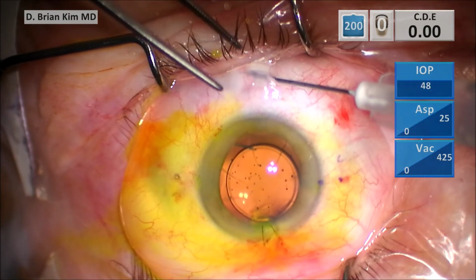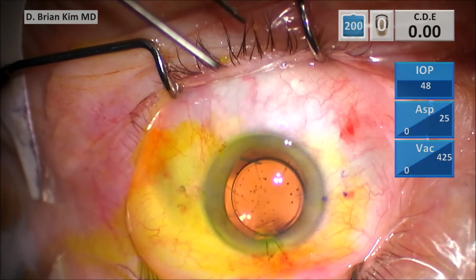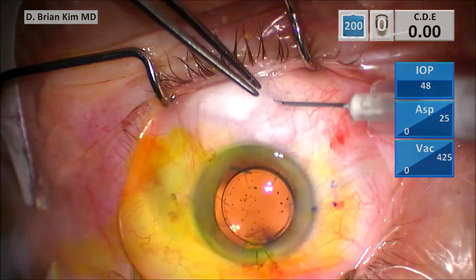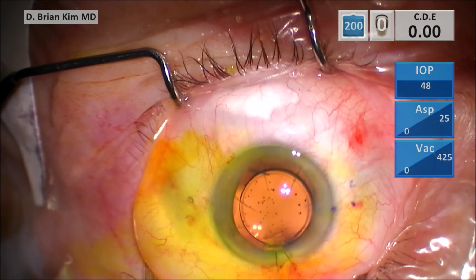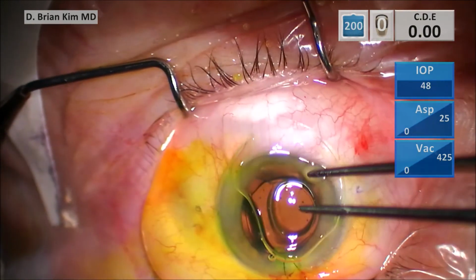But then you saw how flat the haptics were on the sclera, and that's because of my previous marks. I made sure I had a nice tunneling of the sclera with the needles, making sure it provides a nice scleral shelf. And then when I pulled those needles out, it was nice and flat on the sclera, good optic location and support. And so this will translate to better refractive outcomes because of the way I execute the surgery.